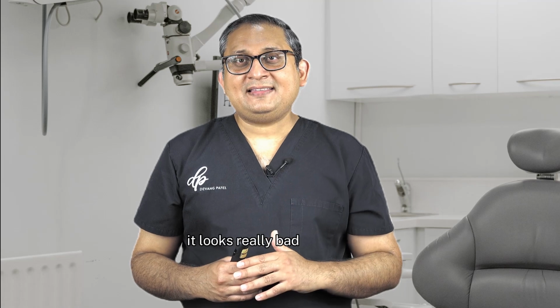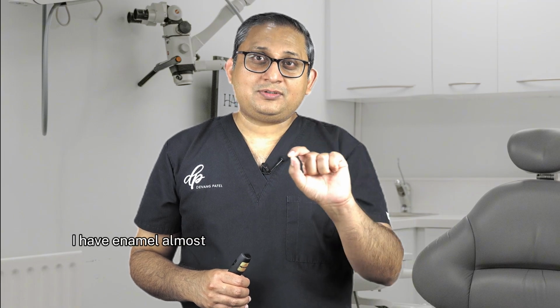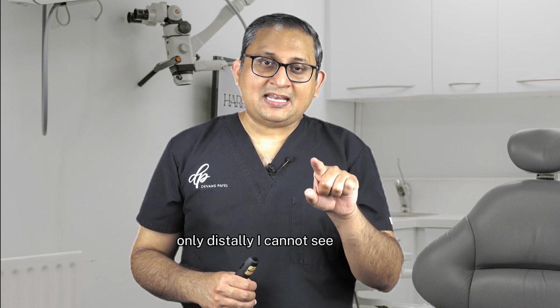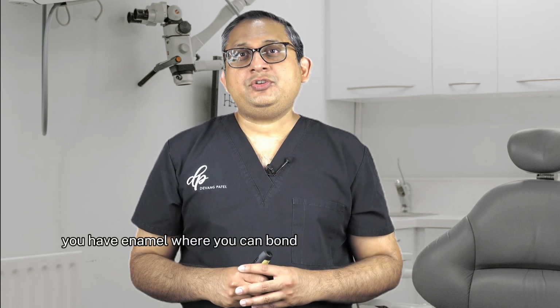It looks really bad in this case, in the sense that it's quite badly damaged. But if you look carefully, I have enamel almost more than 180 degrees. Only distally I cannot see enamel. Otherwise, you can see the enamel rim around the tooth, and that's the crucial bit. You have enamel where you can bond to, and that's where it will make or break when you're doing DME.